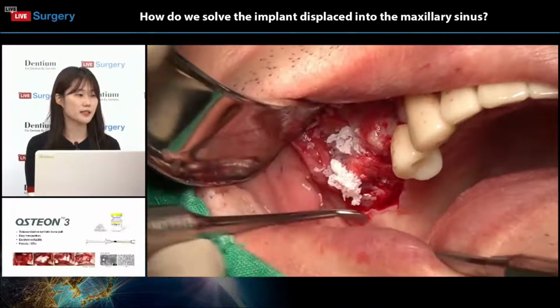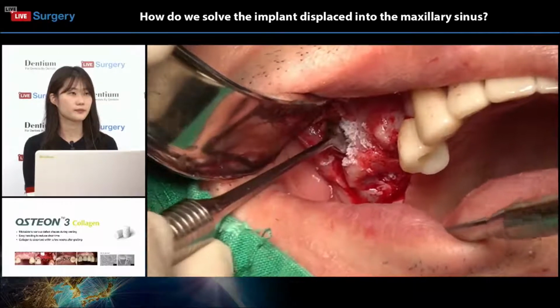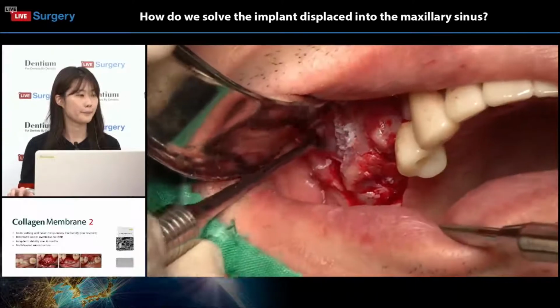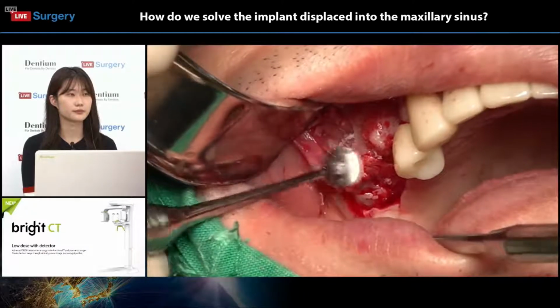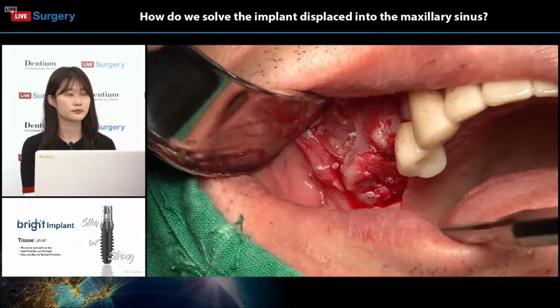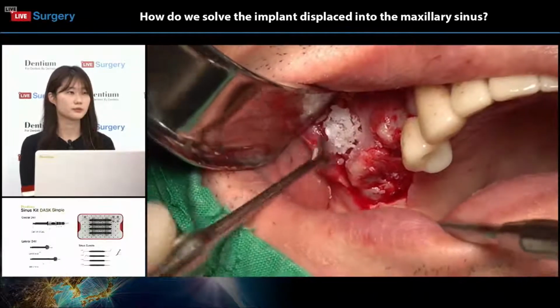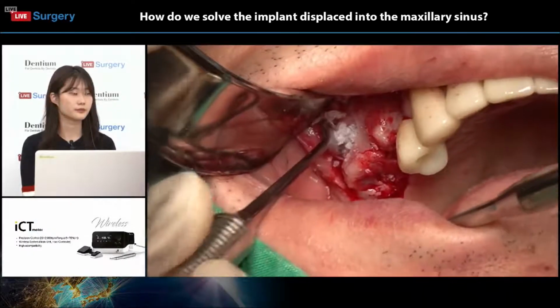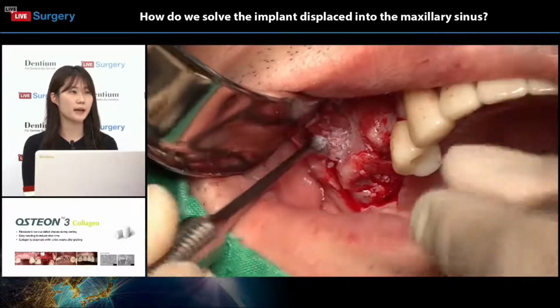And the organic substance is completely removed in this material. You can see the particles gradually filling up the gap.